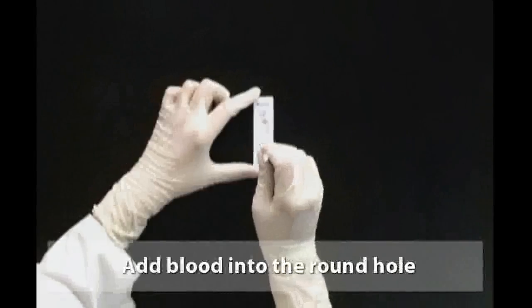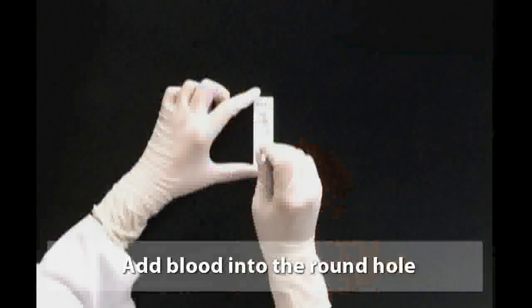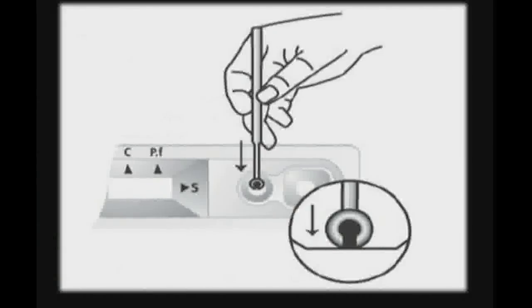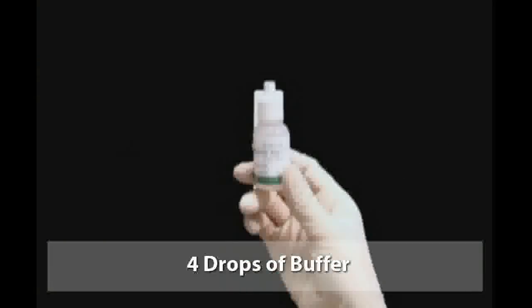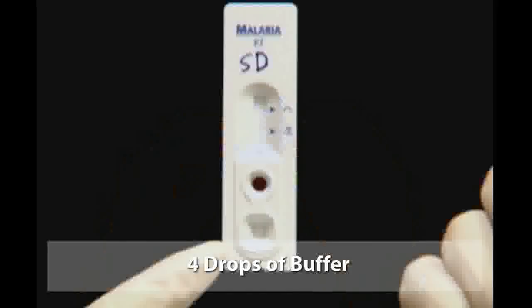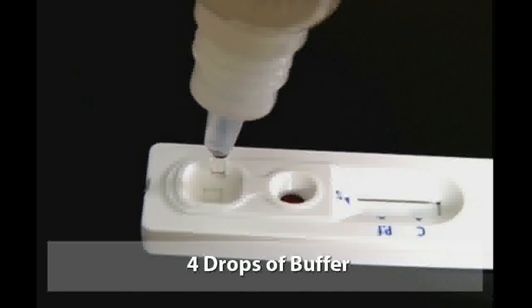Add 5 microliters of dipped blood into the round sample well, touching the sample pad. Remember, let the circular end of the loop touch the sample pad, then press down lightly. Add 4 drops of buffer into the square buffer well. 1, 2, 3, 4.